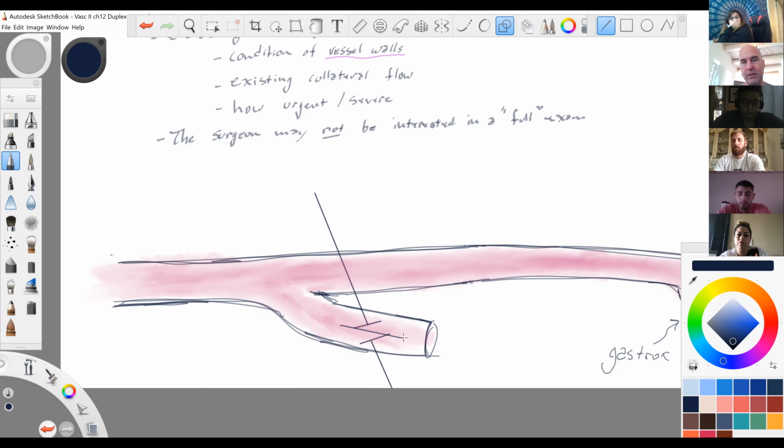I mean, some branches, yes, go into the lower leg, but for the most part, it feeds the thigh. So there is not as much Windkessel effect. So if your waveform is a little more like a biphasic flow, that's fine. That is okay for this vessel. The rest of the vessels that you see on the screen right now, we're going to want triphasic flow. If we don't have triphasic, we already have a problem.